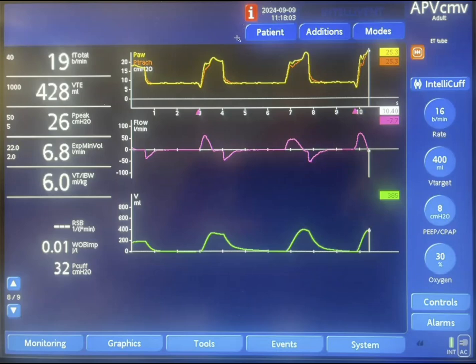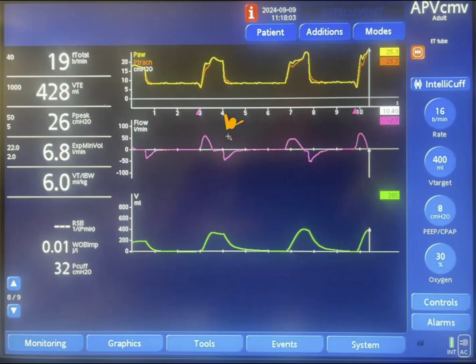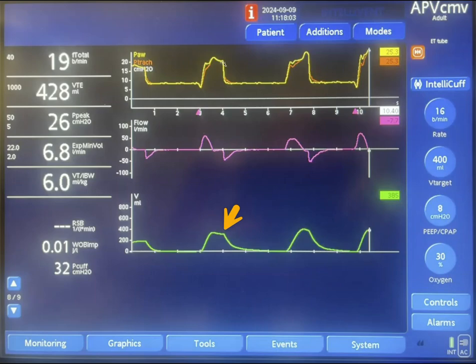In this graphic, this is the end of inspiration where the pressure is released to the PEEP level. At the same time, the flow becomes negative, or expiratory flow, and the volume starts getting out of the lungs. Notice that this is the cycling of the machine, meaning this is the end of inspiration.